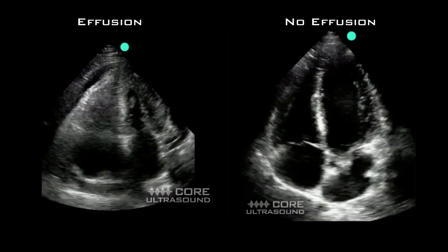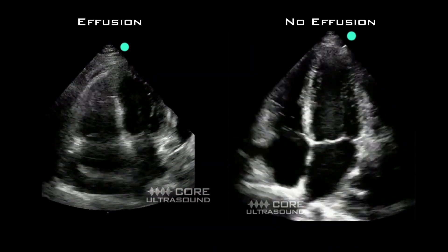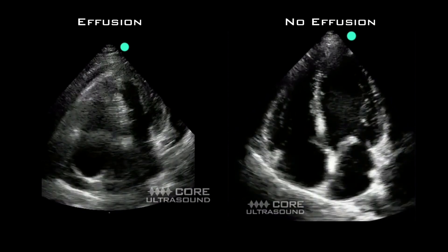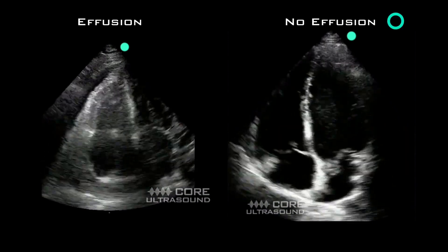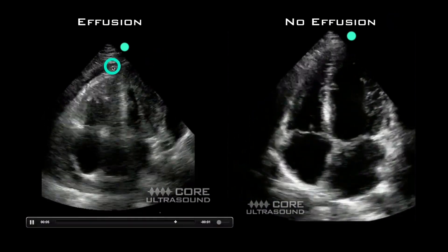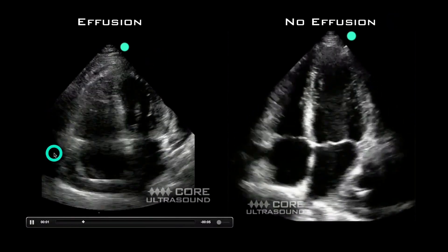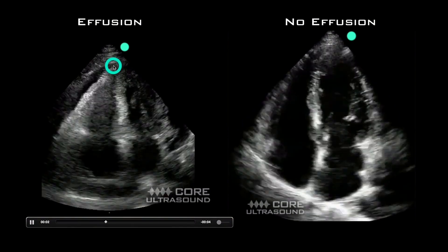You don't just have to use a sub-xiphoid view. This here is an apical four chamber view — normal on the right, abnormal on the left, showing a little sliver of a pericardial effusion.